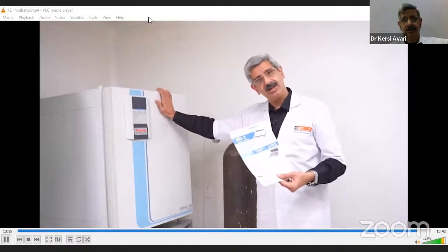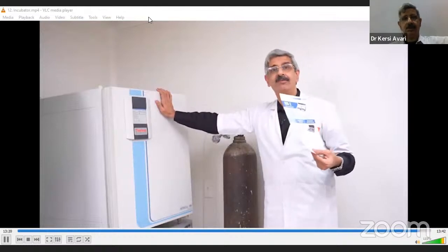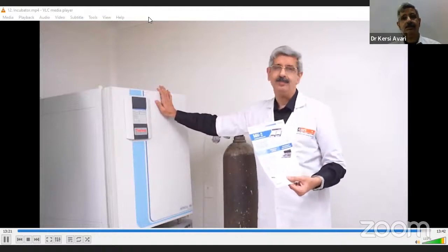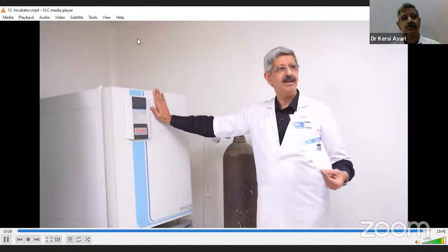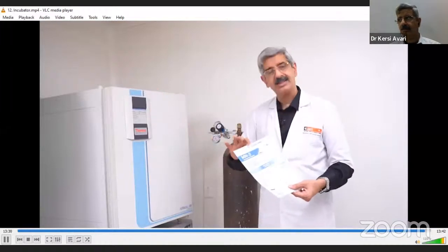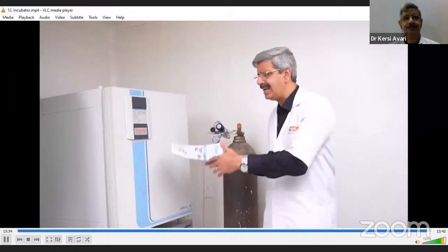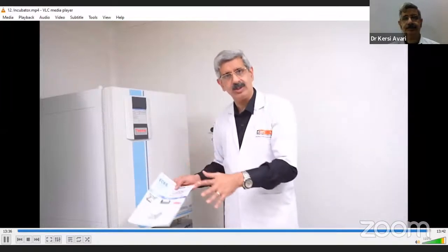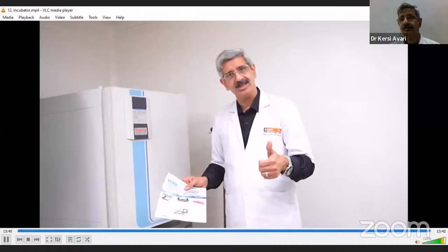They are the king for the initial phases, from the media equilibration till at least the 4 cell or the day 2, they are really preferred. Subsequently from day 4 till day 5 or day 5.5 till the blastocyst condition, some people prefer this, or some people prefer to have an added extra second incubator in which gametes for prolonged incubation till the blastocyst are done.